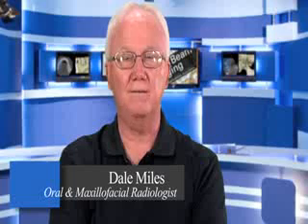Now, when a dentist adopts cone beam CT, do they sort of need to retool their radiology skills? Well, Scott, that's a great question. The manufacturers actually do a good job of teaching the staff and the doctor how to use the equipment in the office, how to actually operate the cone beam machine and acquire the image. But most of the information that the dentist is looking at comes with looking at the slice data.